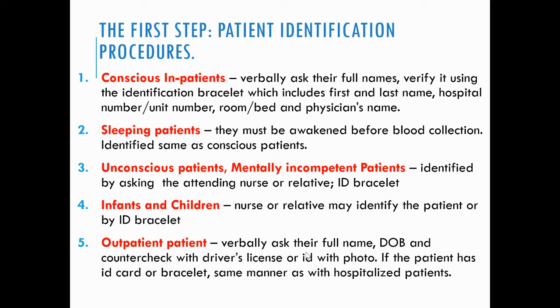And infants and children, we need to identify them through the nurse or any relative who can identify the patient, or by using the ID.